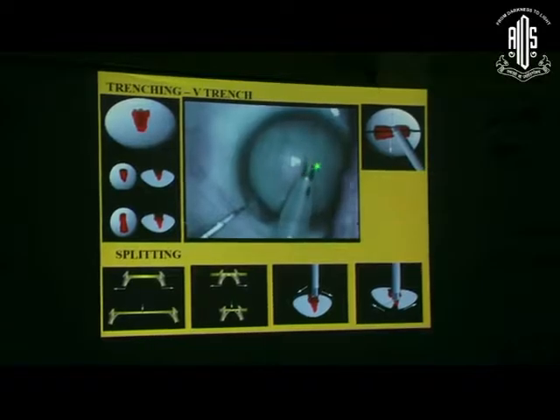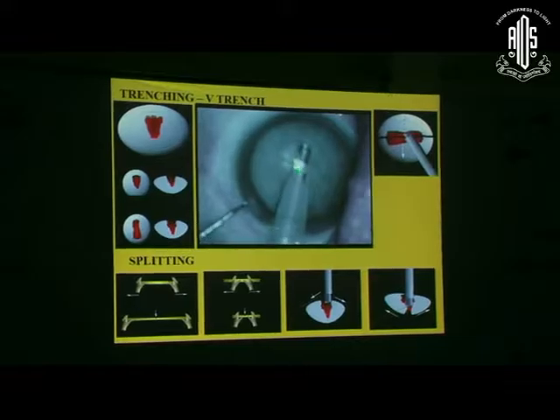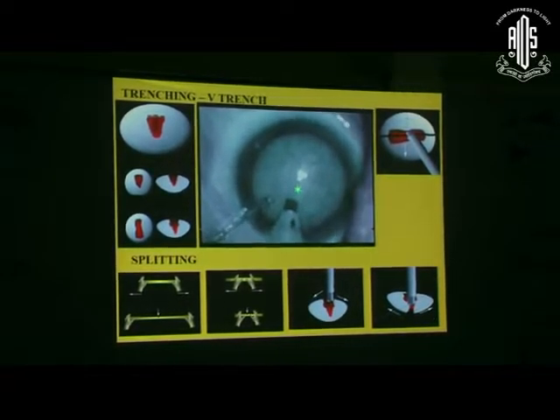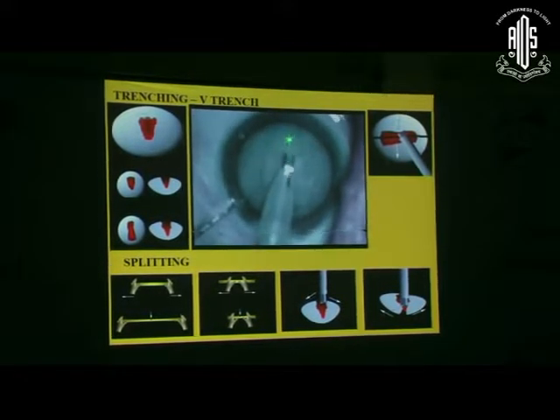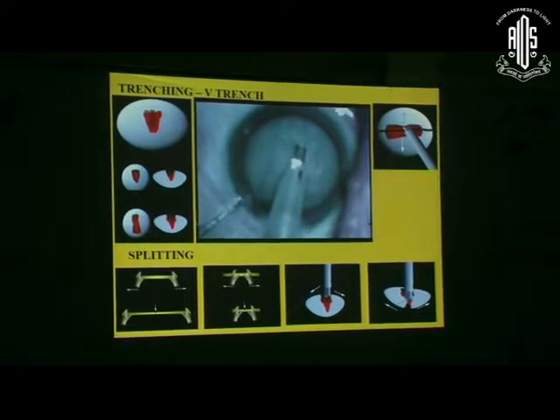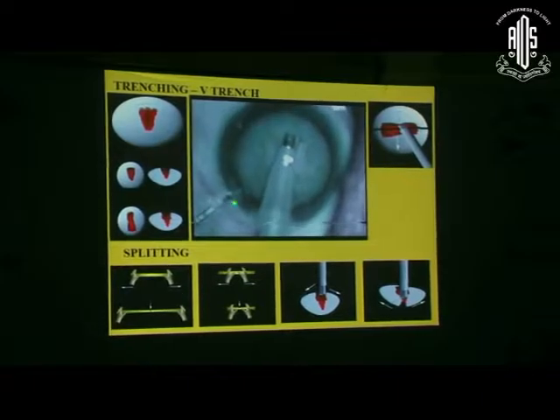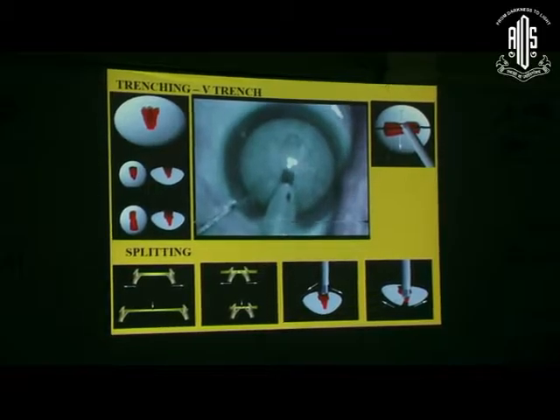What I am going to describe is a special type of trench technique I call the V-trench. When I make the first trench in the center, it keeps on slipping and I am not able to widen it well. So instead of making the first trench in the center, I make a trench that goes slightly off-center to one side, then make another trench - so in this animation you can see it forms the shape of a V. The advantage of this V is that you are able to make the trench very comfortably. There should be no air bubble formation when you are delivering energy - if you are giving too much energy, there will be air bubble formation.